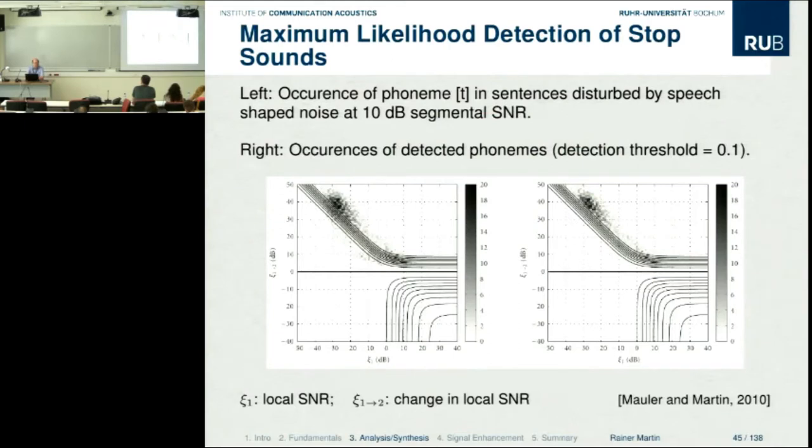We make some assumptions that the signal is Gaussian, and we do some statistics on the signal, and then construct a maximum likelihood detector by comparing the power before and after for short and long windows, and then make a decision whether this is still stationary or it's non-stationary.